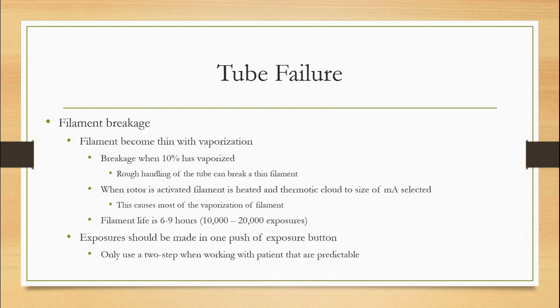So the rotor is going. When the rotor is going, what happens also is the filament is heated and it boils off the electrons. So it's up there boiling, boiling, boiling, and that will cause vaporization or early death of your tube. So do it in one sweeping motion.